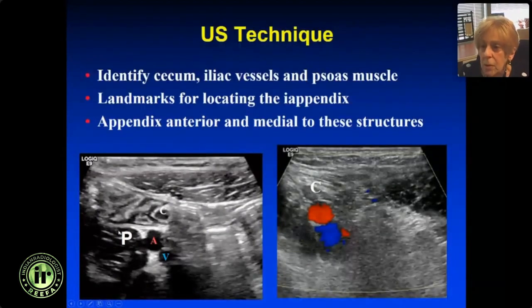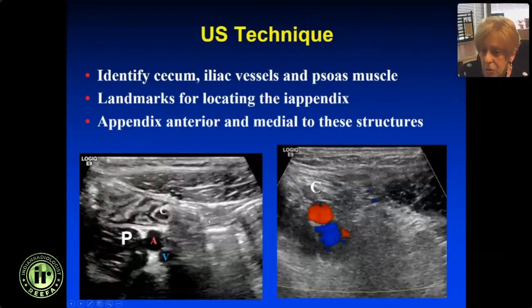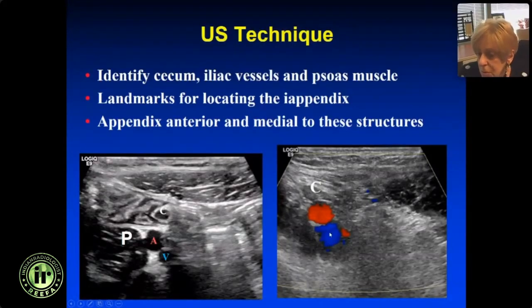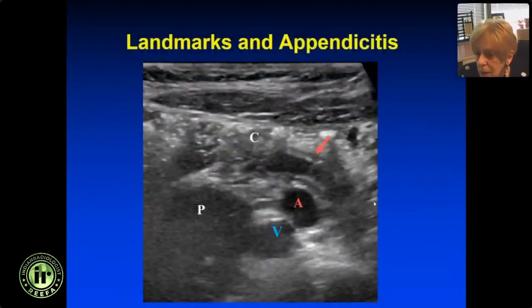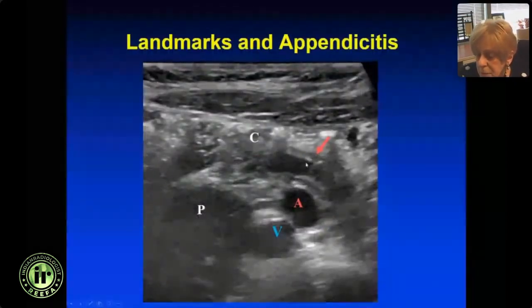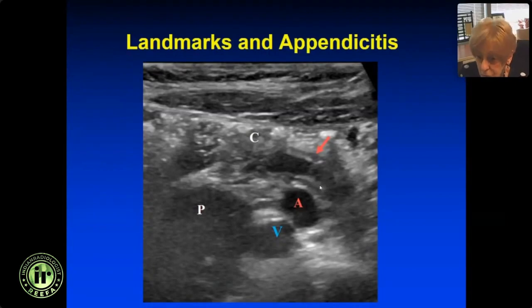There are landmarks for locating the appendix. You start the ultrasound, identify the cecum, and identify the iliac vessels and the psoas. If you can find these, the appendix in most patients will be right there, arising from the cecum, anterior and medial to those structures. Put on color images to increase your confidence that you're looking at the vessels. Here's the cecum, psoas, artery and vein — and this is the appendix lying anterior to these structures.